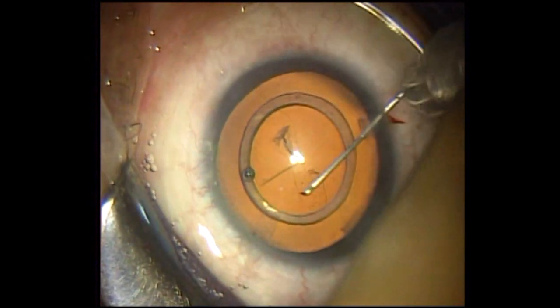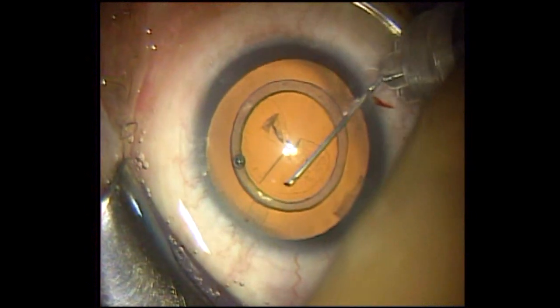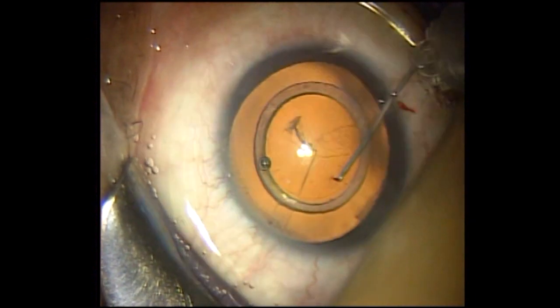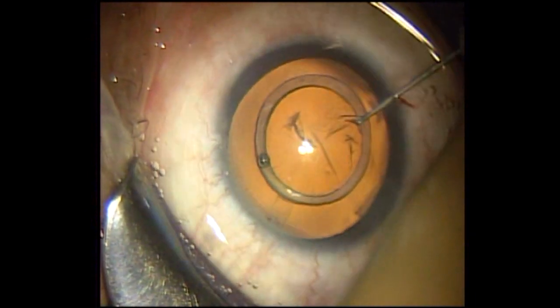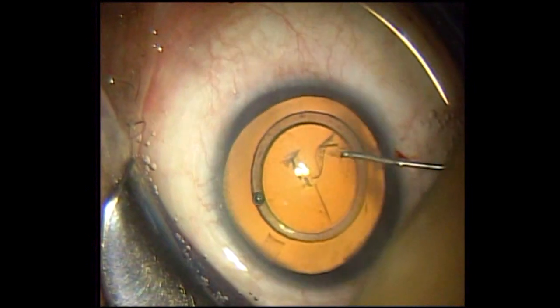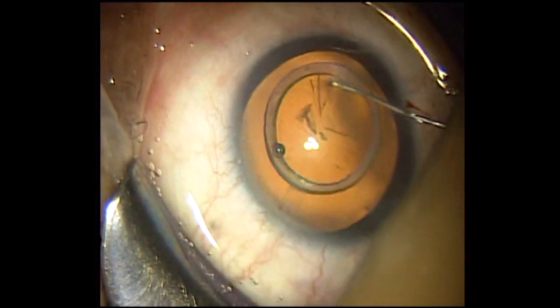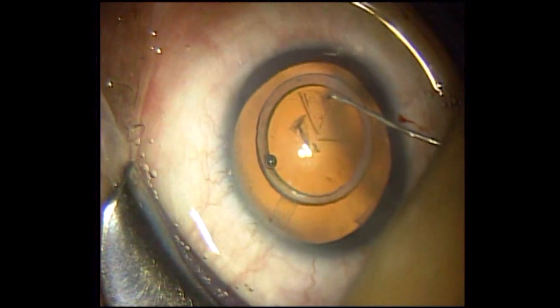The CCC will run parallel to the inside margin of the silicon ring. The inside margin will help you to guide a perfect round and perfect shaped CCC. Just to show you how the CCC caliper helps you to make a perfect round and perfect shaped CCC, this portion of the video is unedited.